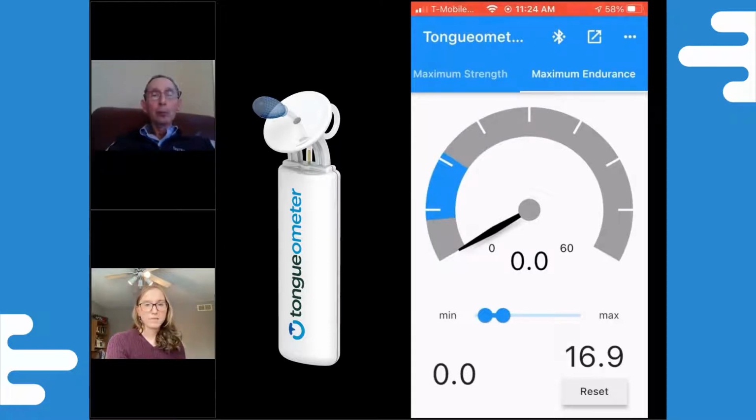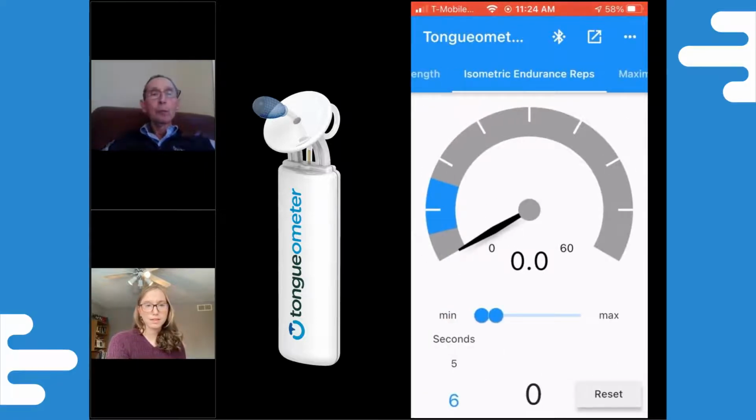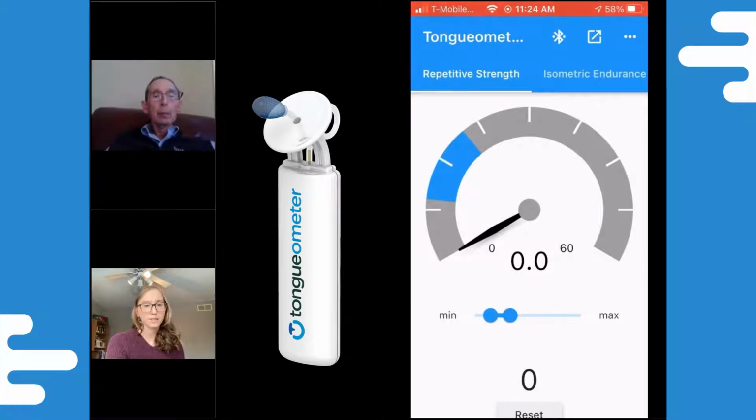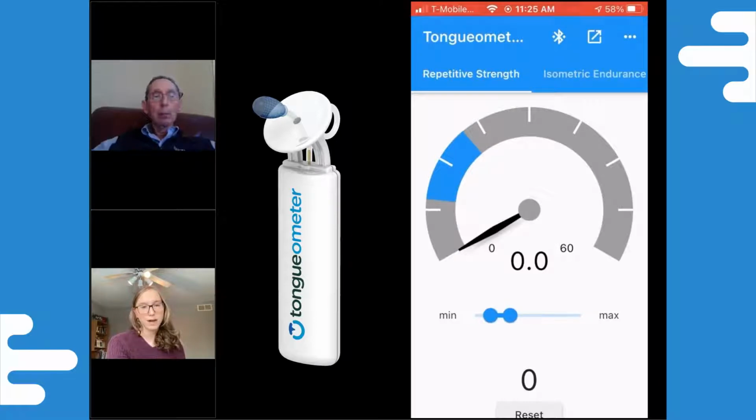So based on that information, then you can set up a patient's exercise program. There's 2 modules designed for exercise, and if you swipe to the left on the app, you'll get to the first one here. So if you go over, Ed, to the repetitive strength, here again, you can set that highlighted range to whatever's best for that patient. Some exercise programs have you set it between 60 and 80% of your maximum strength. Again, patient specific, whatever's most appropriate for that patient.